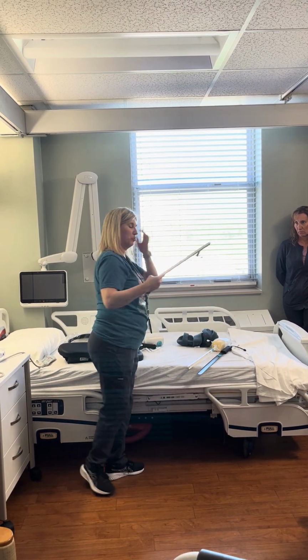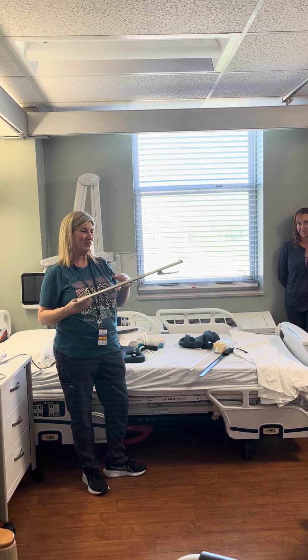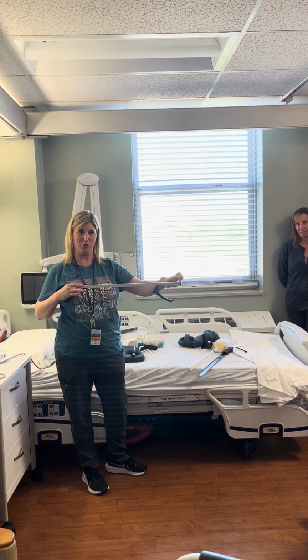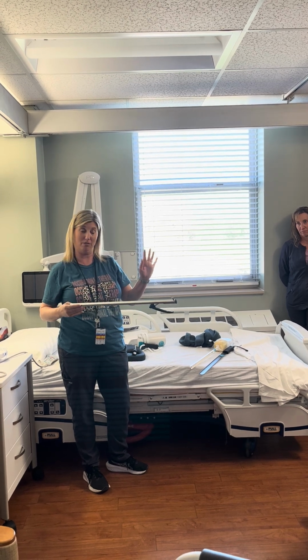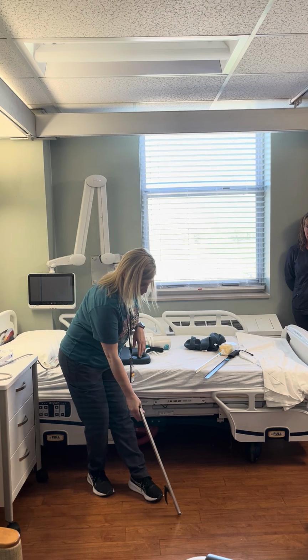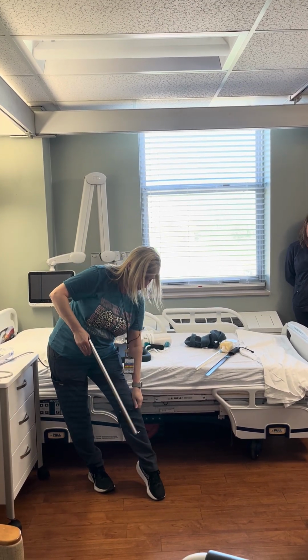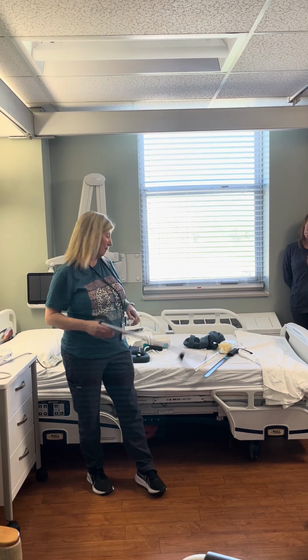We have our reacher. We all know what these are. So, yeah, this is a magnet. Doesn't work super well, but they love it. The veterans love the magnet. We use it mostly to pick the pants up, pull it up their leg, thread it up until they could reach it, and pull it up the rest of the way.